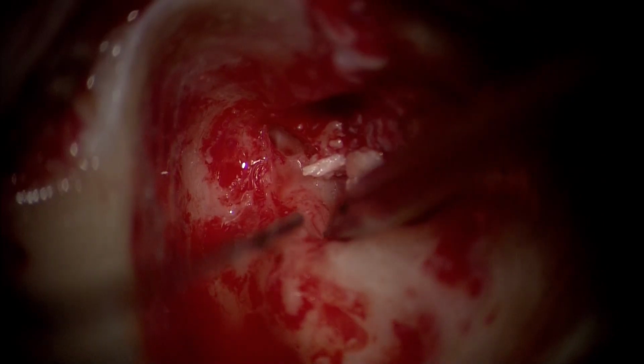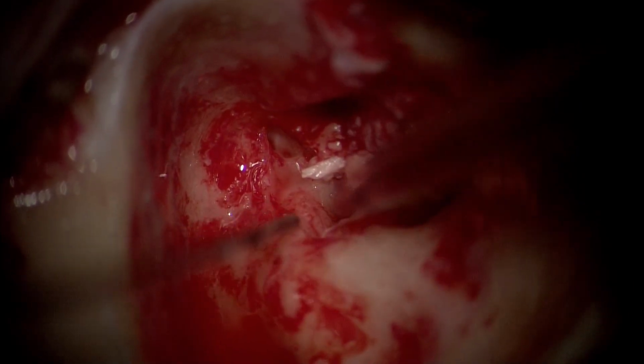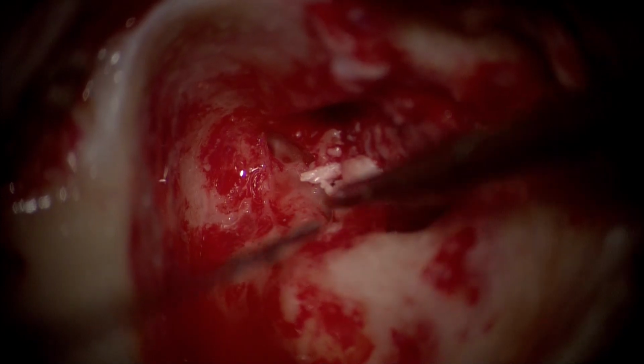Now, once you see, we are gradually using different sorts of instruments. One can also use a whirlybird dissector, which is turned towards a certain side. But you see how epithelium now can be differentiated from the actual facial nerve. We are using a thin suction that is appropriate for this kind of work. The dissection must happen from superior to inferior and from posterior to anterior. This is what the convention says.